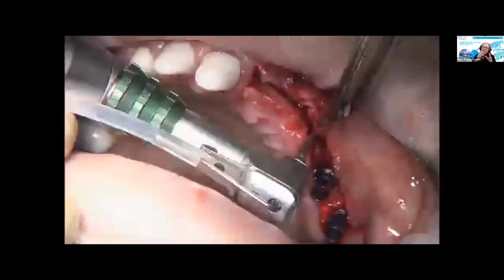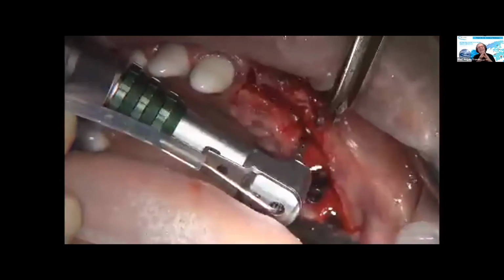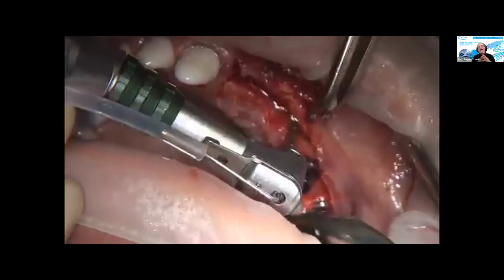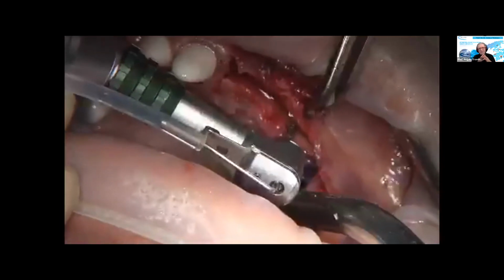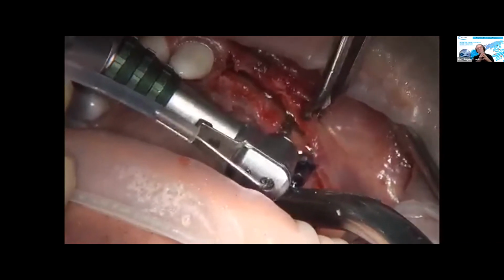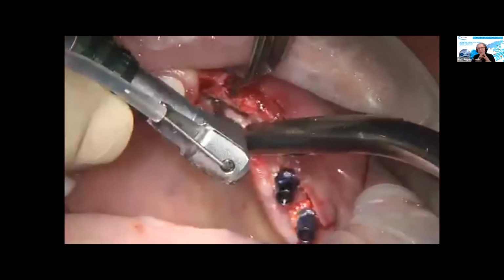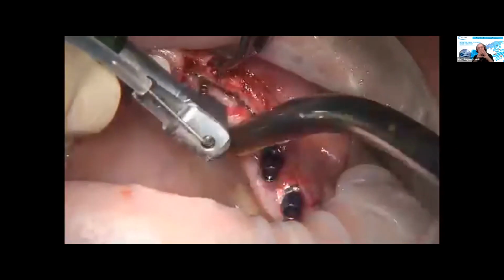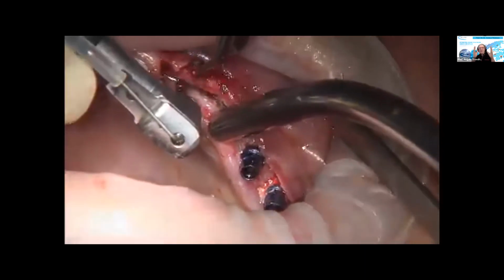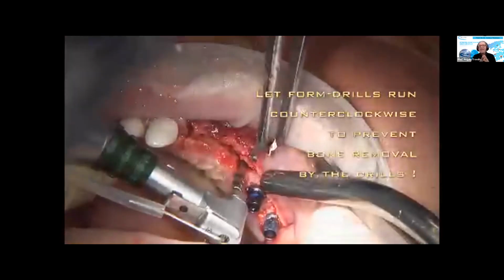But for your first 30 to 40 surgical procedures, please, once again, exactly follow the protocol and don't skip any step and don't misadjust the piezotome. You have to use the right adjustments to be successful. But it's very easy. It's written on the leaflet. Now, once the widening is finished, you can see whenever I put an instrument in between the distracted bone plates, it goes open. But once you leave again, it goes back again because bone is elastic.